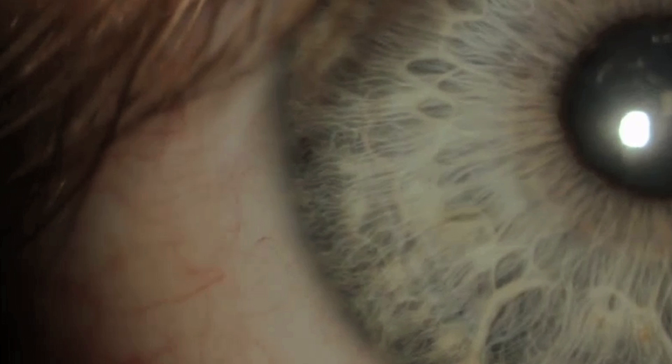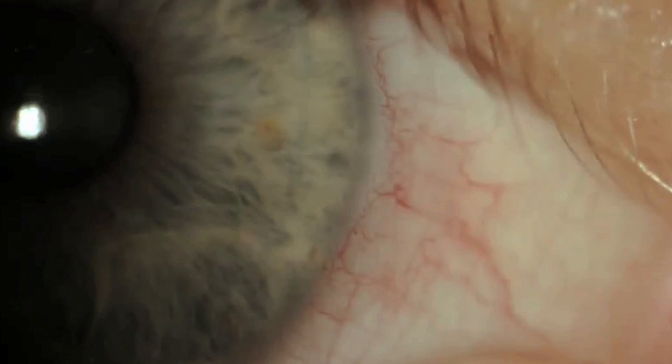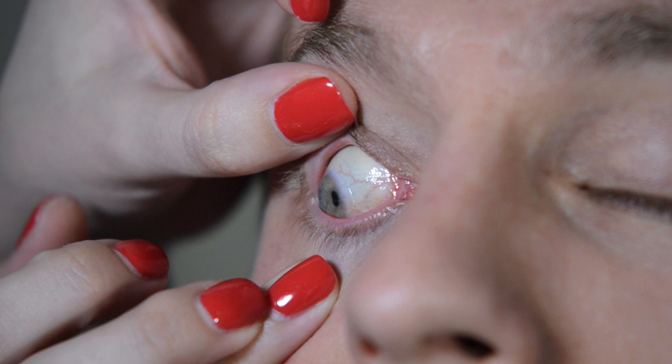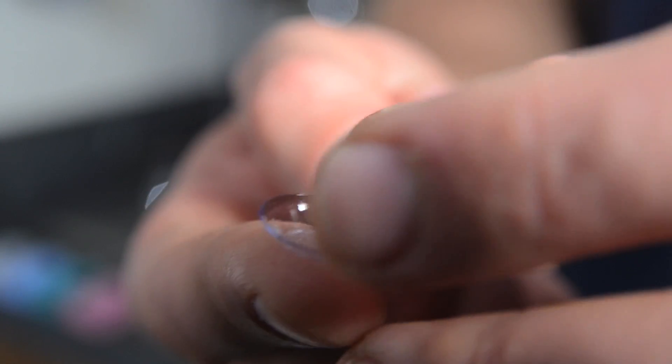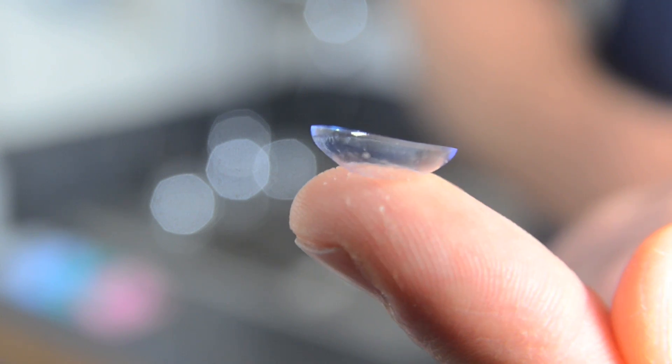If the lens does move and fall easily, you can be confident that it's not too tight and okay to dispense. If the patient has good vision and a properly fitted lens per your assessment, the last step is to evaluate patient comfort. If the patient's uncomfortable but the lens fits well, look for something stuck under the lens that might be causing irritation. Do a scleral wash by moving the lens onto the sclera and back to see if that fixes things. If this doesn't solve the problem, remove the lens and see whether it might have been inside out — if so, reinsert and make sure that comfort improves. If you're not successful with either of these techniques, then consider switching to a different lens.